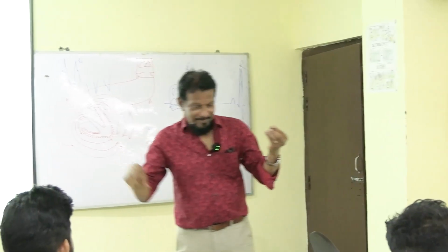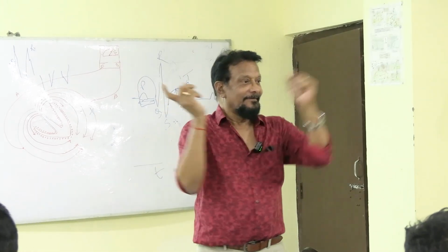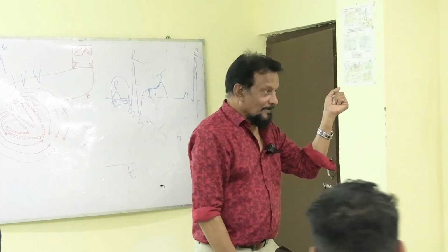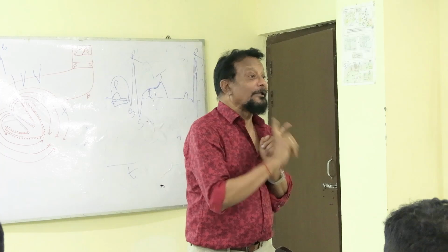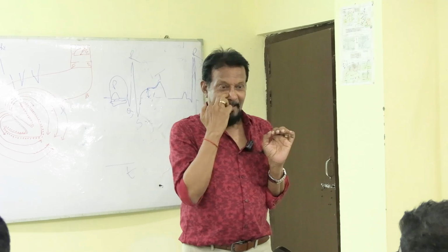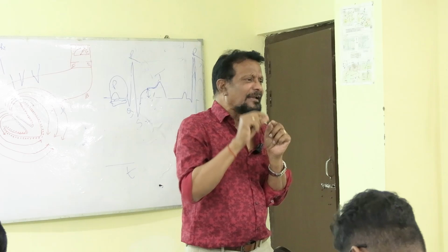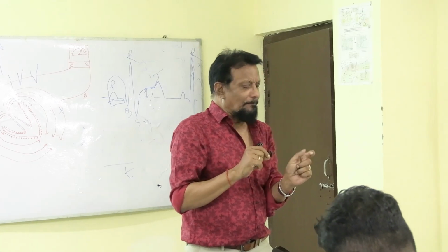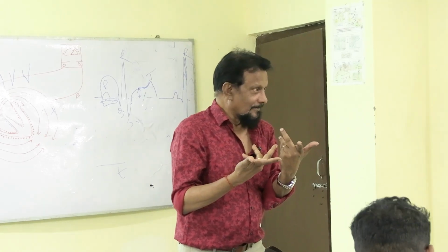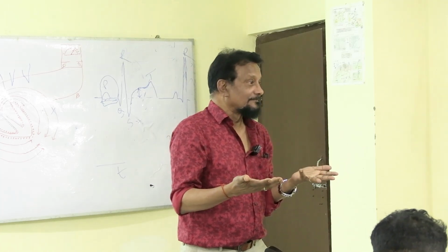Now this positive pole I will place in the right hand, in the left hand, in the left leg. Now they are called unipolar. When we record the ECG, their amplitude is very low, so I have made one arrangement to amplify, to augment this. What is the meaning of augmentation?